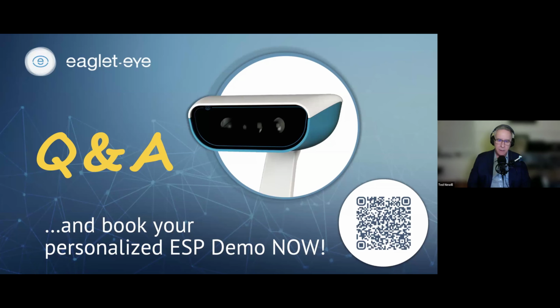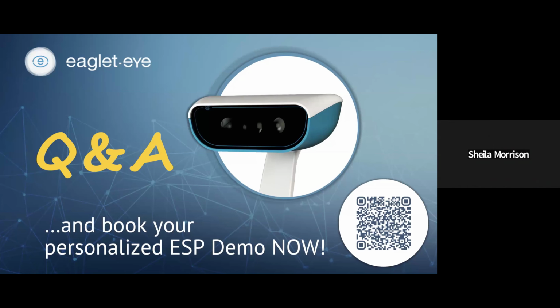Okay, excellent. Ted, I'm going to throw in one last thing that I thought of, which is another differentiation for which topographer to choose: what I'm planning to do with a manufacturer lens design. There are different compatibilities with topographers to be able to build lenses, especially if we're making an empirically designed lens. Labs generally play pretty nice with most topographers, but there are some that are superior with one topographer or the other.